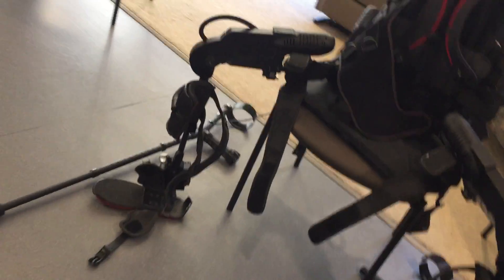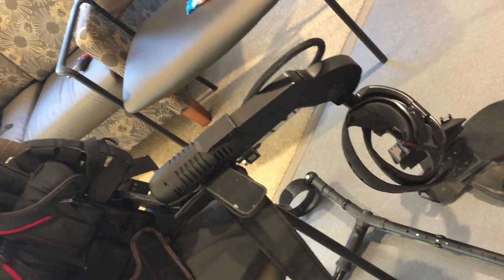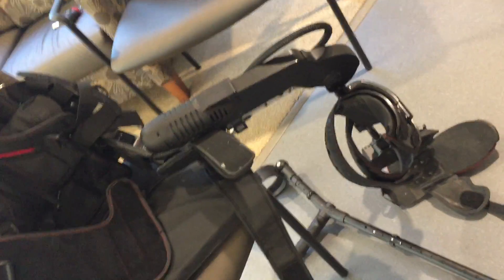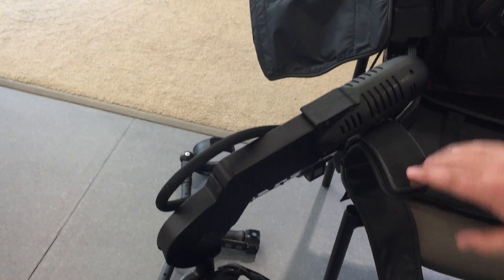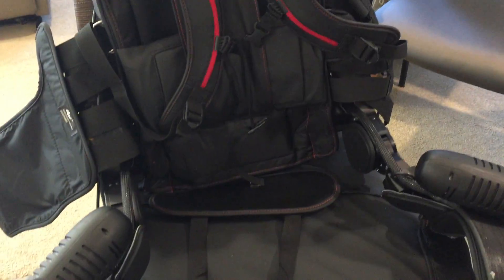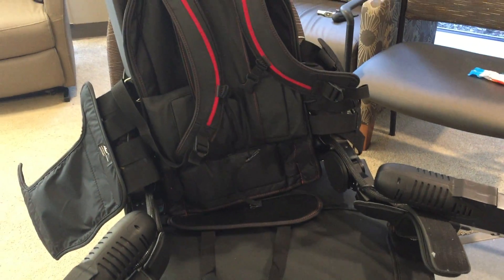In terms of how a patient might put on and wear the device, normally one to two physical therapists will help transfer a patient in. A patient will sit right in the middle, the legs will wrap around the patient and they'll be strapped in. There's a backpack strap here that will help secure them in the torso, and then allow them to go from a sitting position to a fully powered standing position.